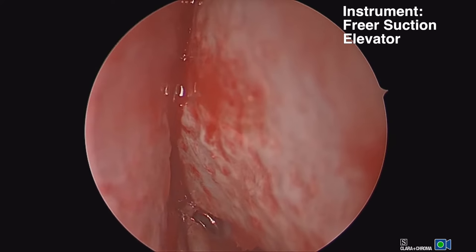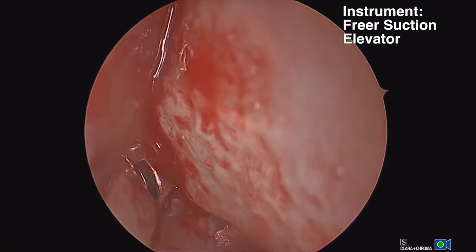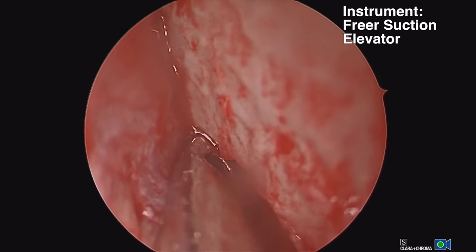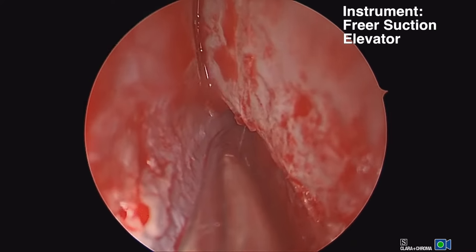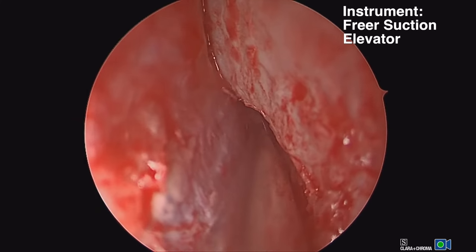We're elevating off the spur in this area here, and we want to have the mucosa freed up before we make our chondrotomy. We're using a suction freer in this case. It's nice with the endoscope to have suction while you're elevating so that blood doesn't obscure your view.